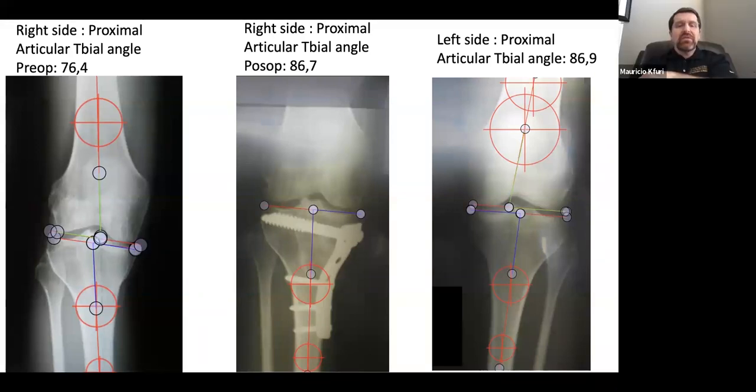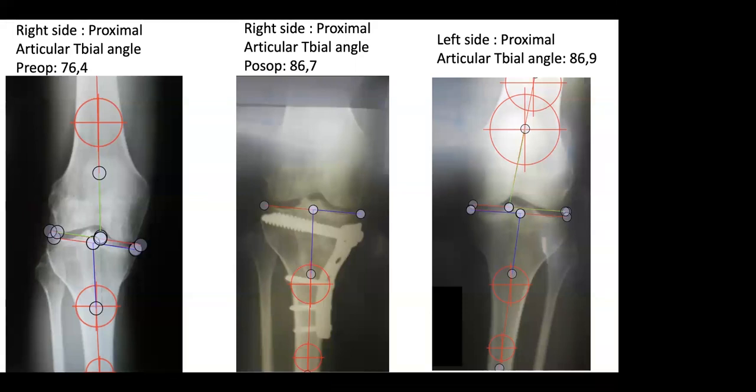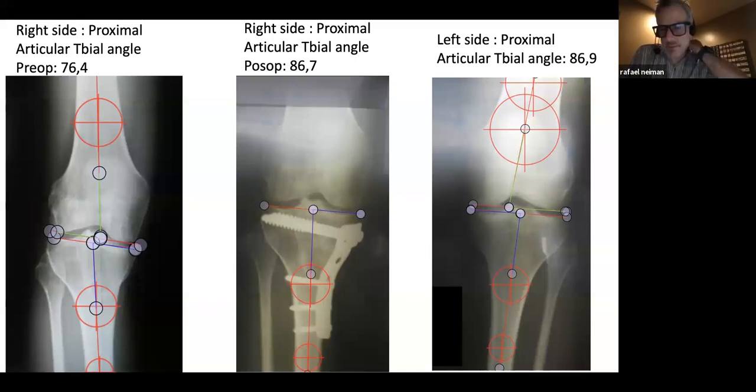You don't have any lateral view, right, of this knee? This is just all I have at this point. Okay, very good. Looks good. I don't think he took down the MCL when he did this. I think that everything was below it. So that's because he had such an oblique osteotomy. He didn't need to take the MCL down.